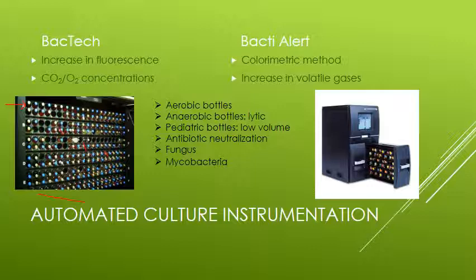Yes, in the manual days, and yes, I had to live through it, we used to have to gram stain all of them, or we would actually do a blind subculture of all of them. You do every single aerobic bottle, you'd have to manually view every single bottle so that you could see if something was growing in there. So it just reduces your tech time incredibly. And in reducing tech time, major money savings, okay?